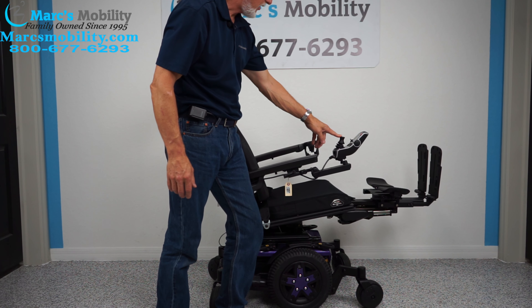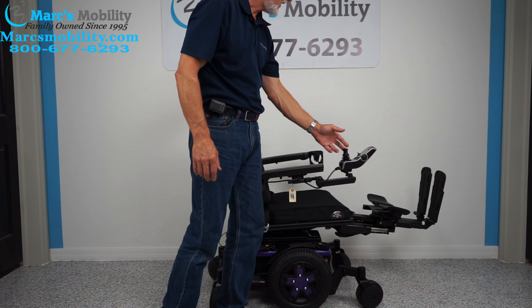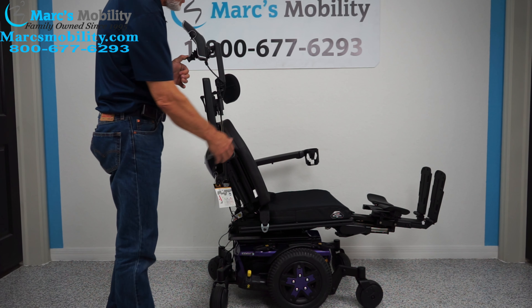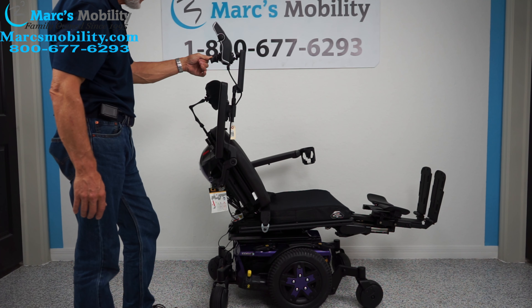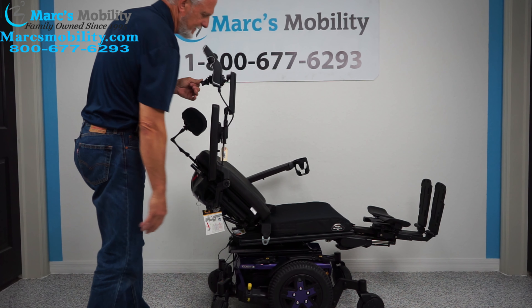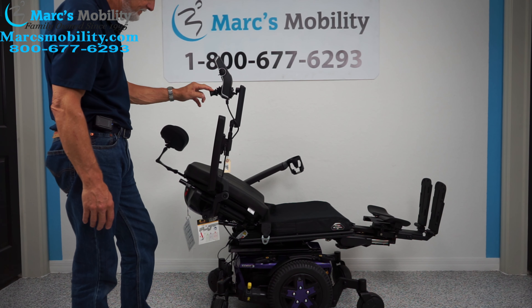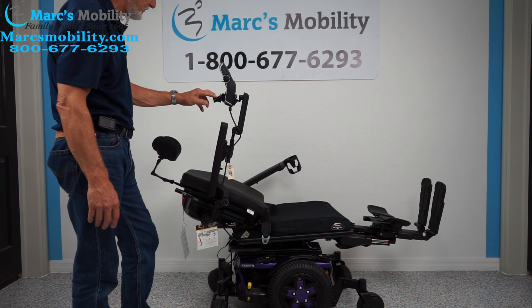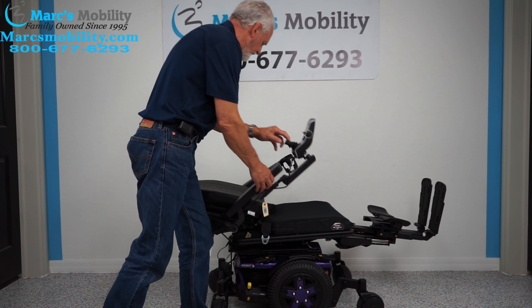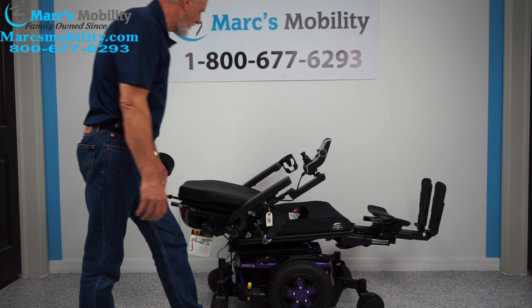The last function is going to be the electric recline. The electric recline is when the back goes back by itself. You can see the back right now going back by itself — that's called the electric recline when only this portion moves back. We'll see how far that's going to go. This is as far as it goes. If you're laying in your chair, this is as far as the back would go.